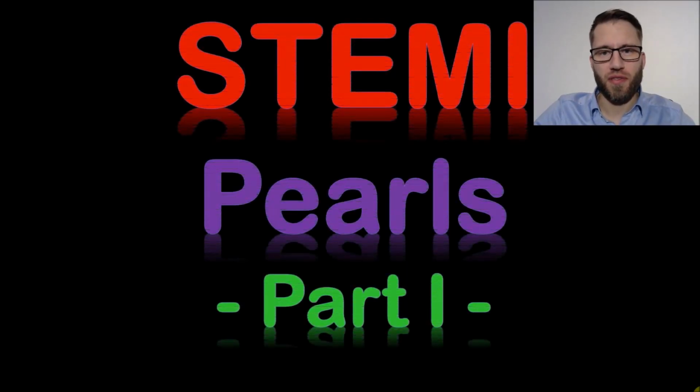I call this video STEMI Pearls. It's part 1. I have some more cases that I wanted to show you, but I split it up into part 1 and part 2. Part 2 will come in a couple of weeks, and this is part 1 of the STEMI Pearls.